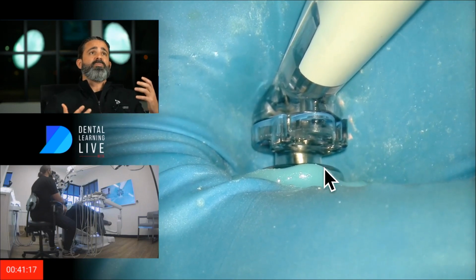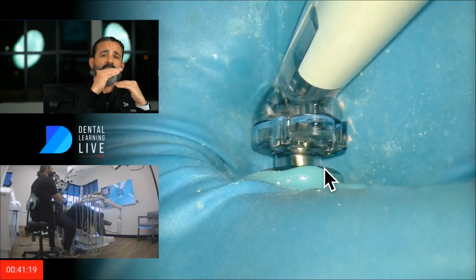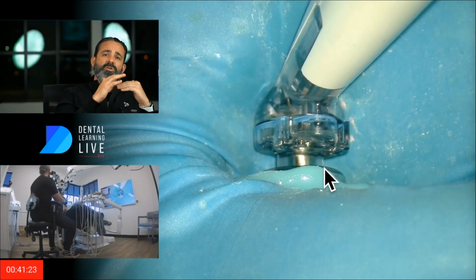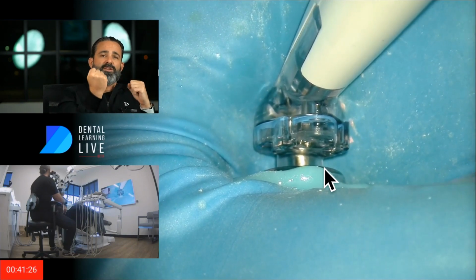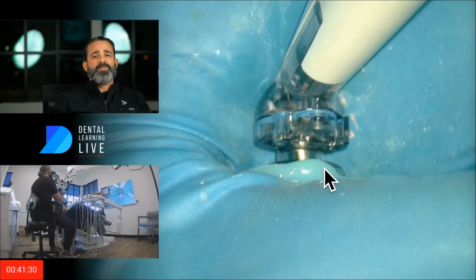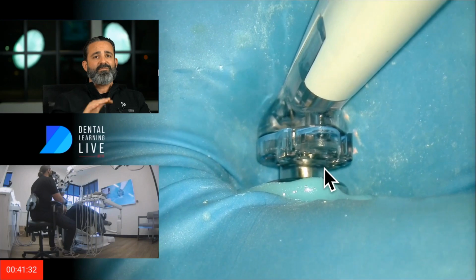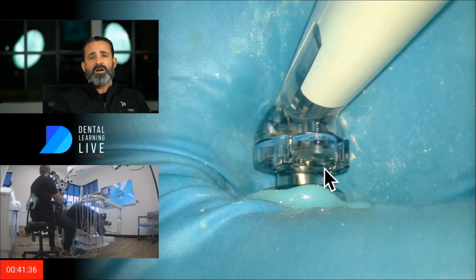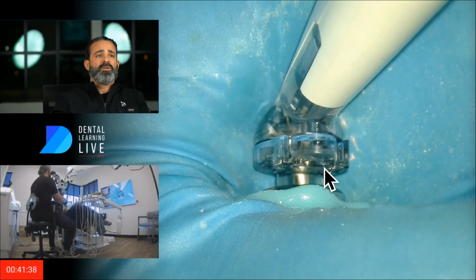So I've learned to find that sweet spot where the negative pressure kind of keeps me on board, and I'm getting more and more delicate on how I posture. I don't grip it anymore. I don't hold it and I don't force it. But the consequence is you've got to concentrate because I'm finding that balancing act. And when I deviate like you saw, I'm just going to pull and then I'm going to correct myself very quickly.